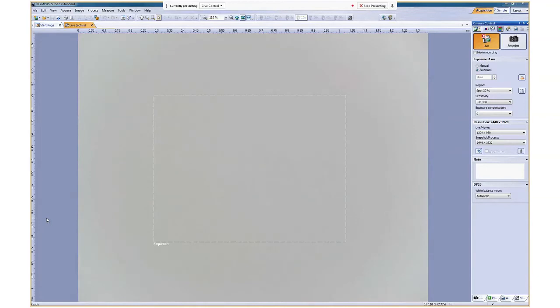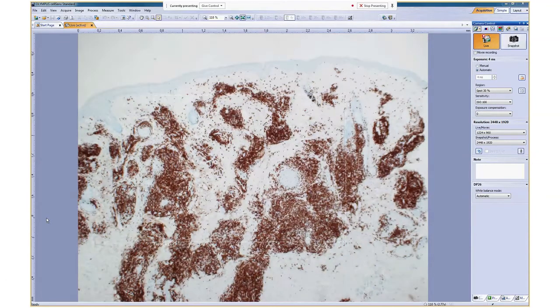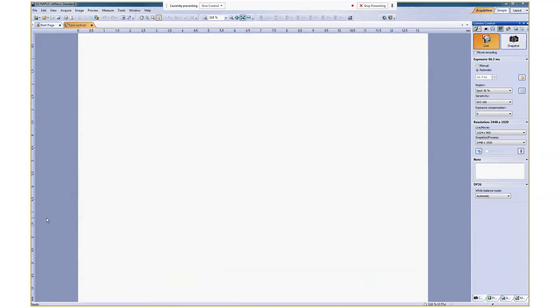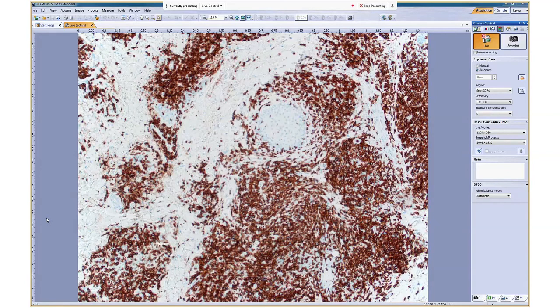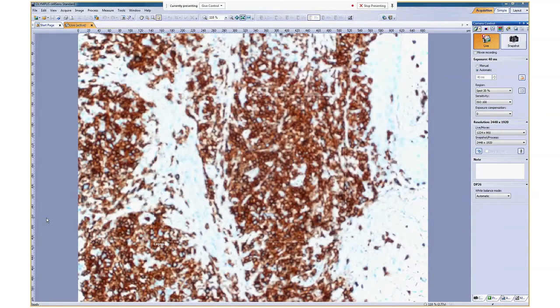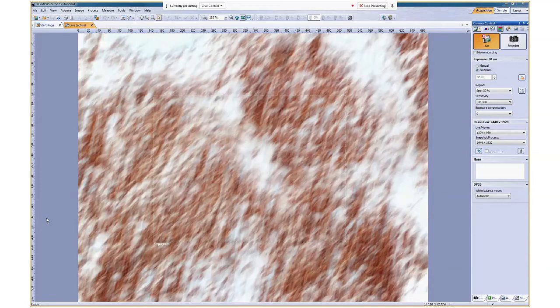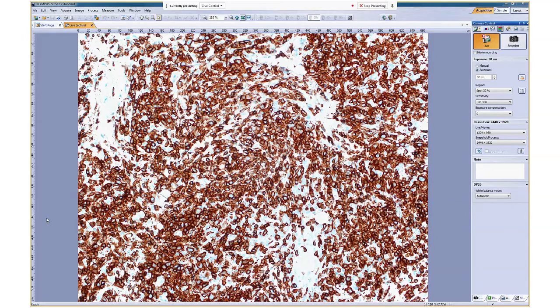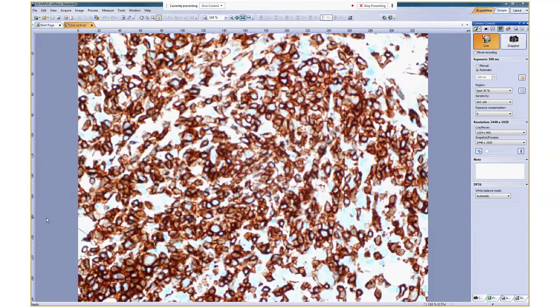immunohistochemical stains, and the lymphoid infiltrate that I pointed out, this is the CD3 stain. So you can see that the majority of that lymphoid infiltrate is CD3 positive. CD3 is a great stain for highlighting the nuclear contours, so you'll be able to appreciate the size of the lymphoid infiltrate. And in this entity, there's quite a good range of size. We'll find a good field here showing the range, and hopefully you can appreciate that there are small lymphocytes, but also intermediate sized lymphocytes. So you can see that there are medium-sized lymphocytes like these.